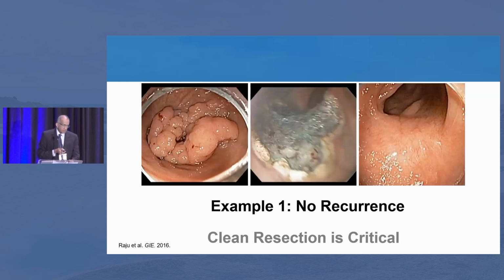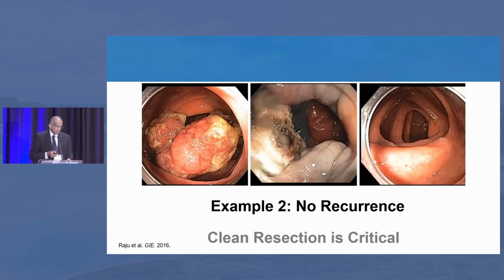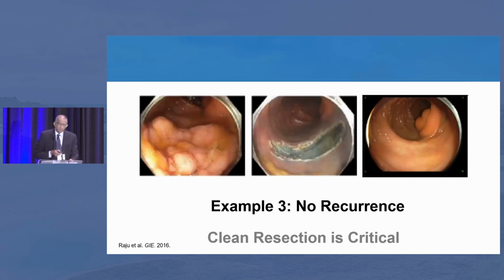So here is a large lesion, and we were able to resect. And this patient I followed for almost 10 years with no recurrence. Another patient, I removed it about in 2012. Actually, I scoped him just last week. I can't even find the scar. And another lesion. So I'm giving these examples to let you know that you can actually eradicate lesions without worrying about too much of recurrence if you follow simple principles that I would like to share with you.